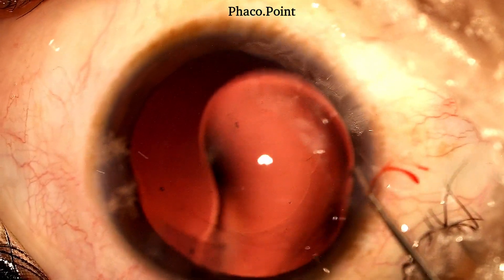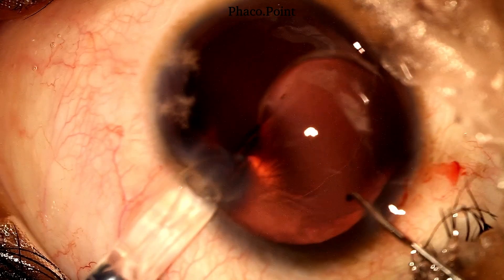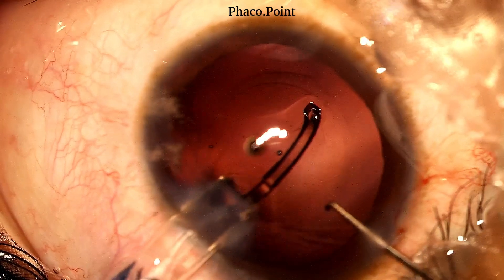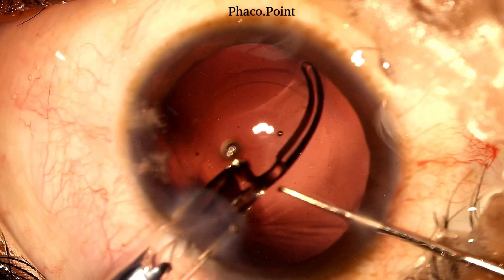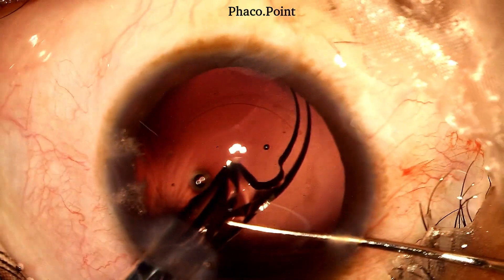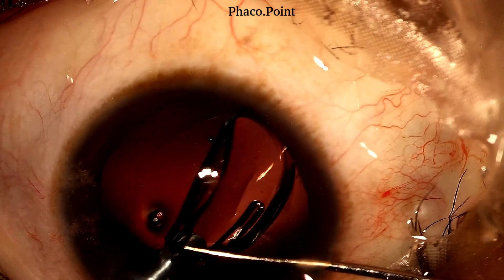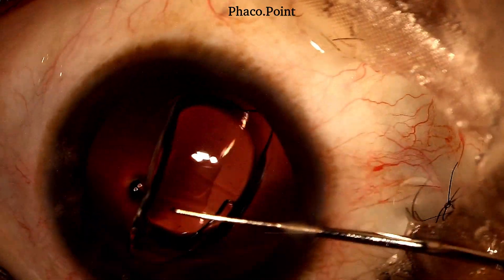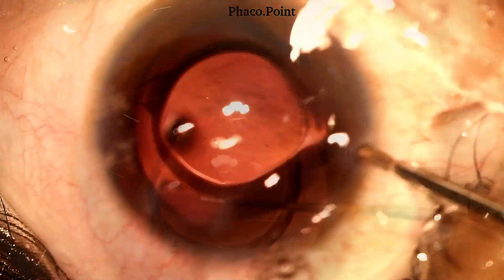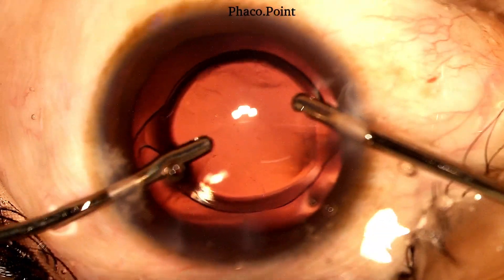We now proceed with the IOL insertion. With adequate counter pressure afforded by a Sinski hook held in the non-dominant hand, and the chamber well insufflated with viscoelastic from the prior visco-fluid exchange, the IOL is now inserted with care and caution into the capsular bag. The excess viscoelastic is then removed with the help of bimanual irrigation aspiration.